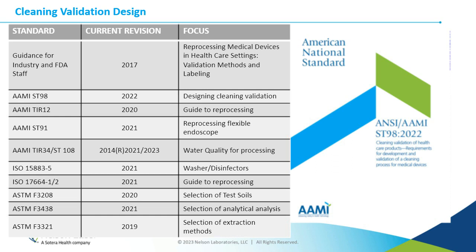But there's a lot of interpretation in there as well. It doesn't tell you exactly what to do. It gives you how you should go about doing them, but it would be between the manufacturer and the laboratory to design the validation plan by itself. But these are a lot of standards. I've only put a snippet of it. There's still probably another 15 that are still being developed and currently worked on just for reusable medical devices. But these are the main ones that have been updated to bring attention to why cleaning validations are so important for reusable medical devices.